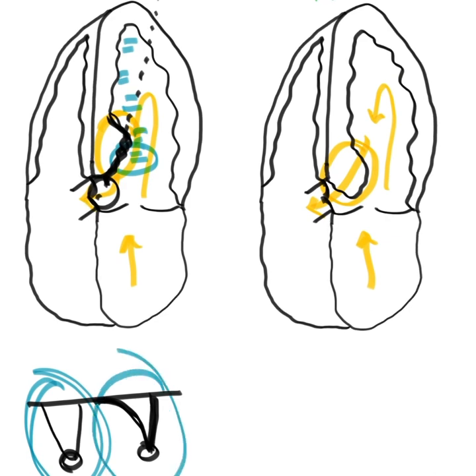But because we know pulse wave will tell you a specific location, whereas continuous wave takes the entirety of that line, right? So this is just telling the doctor, this is exactly where that gradient is coming from. This is where the issue is arising.